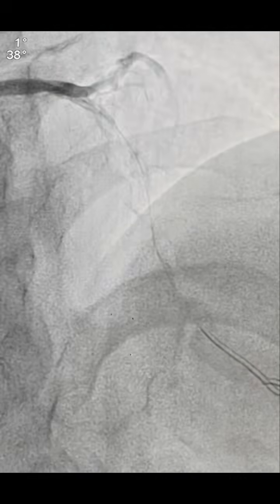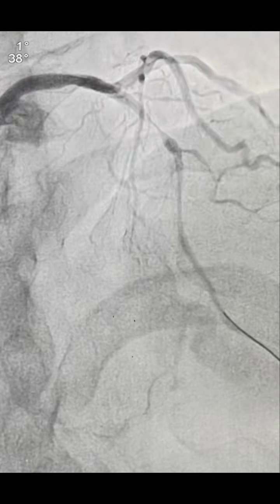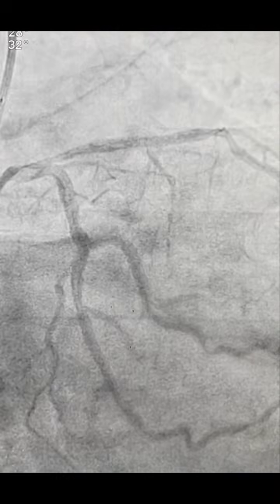I made the knuckle in the distal LAD. It was a very small LAD distally. And this was the 2.75 into 20 stent deployed in the mid LAD at 12 atmospheric pressure. Nominal was 8. And this was the scene after the stent deployment in the mid LAD.